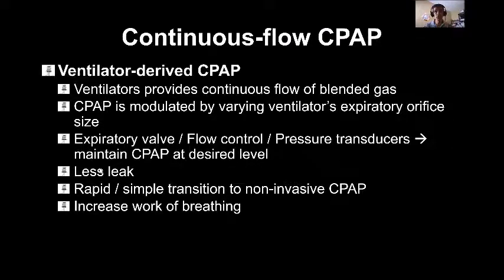Of course, there is no leak because it's all sealed. And the other thing is it's simple and rapid. So if the baby is ventilated and you extubate, you put them on CPAP using the same machine. Or if the patient is on CPAP, you don't need to switch the machine; you intubate and use the same machine. So it's very good when using continuous flow CPAP provided through the ventilator. It's easy to transition, step up or step down from the ventilator.